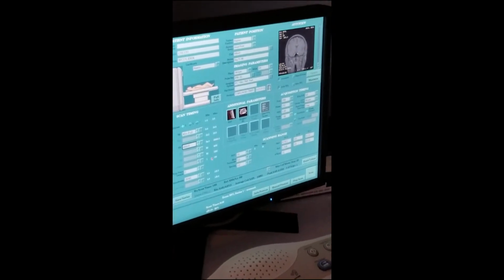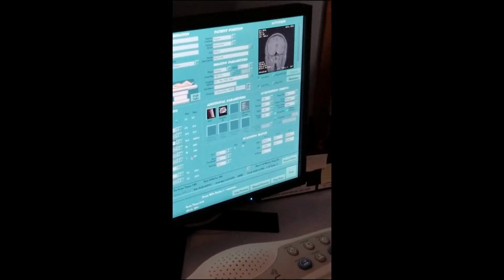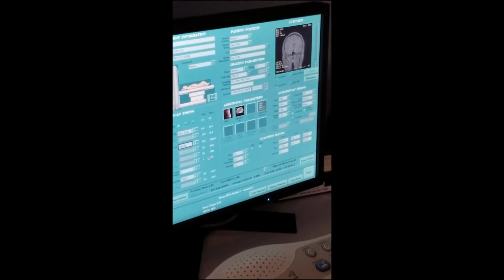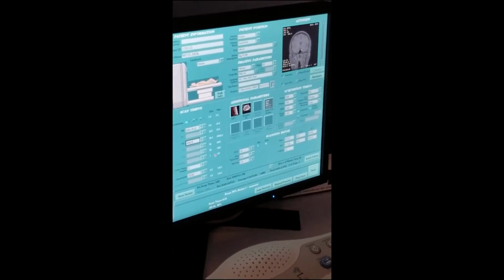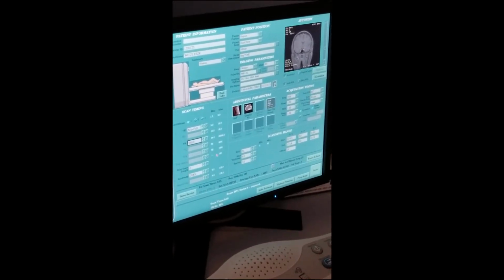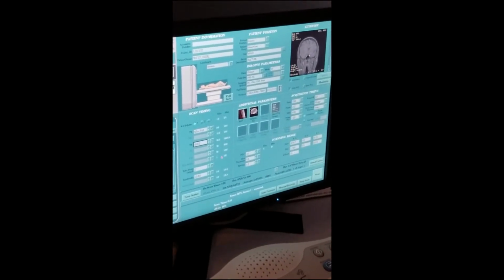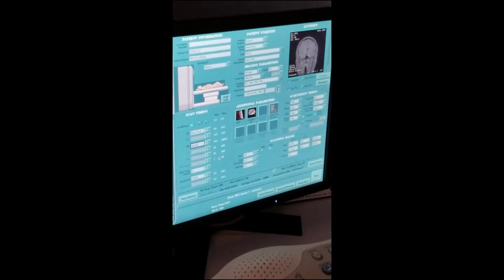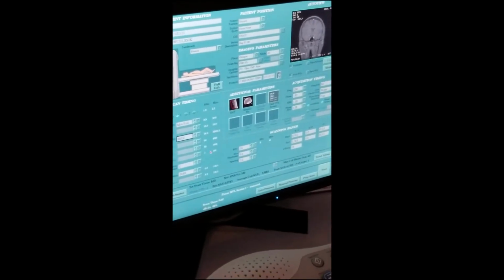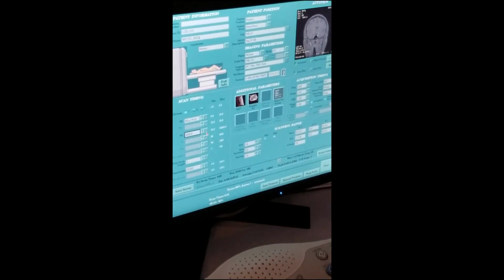But there is also another issue. What about if you needed 40 slices, hypothetically? Can you keep going either low or high? No, because if you keep going low, there is a threshold for how short your TR can be. On a regular, bread and butter type of image on this machine, we don't want to go below 400. And if you need to add more TR, can you go up to 1,000? No, because it's no longer a T1.